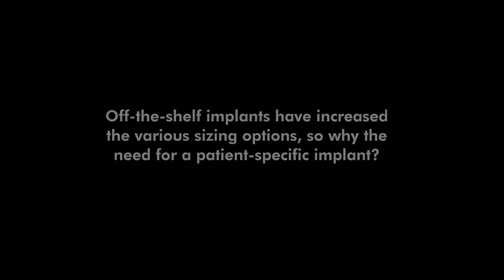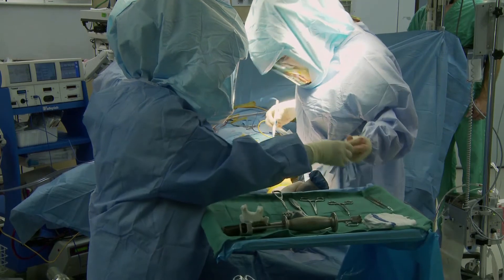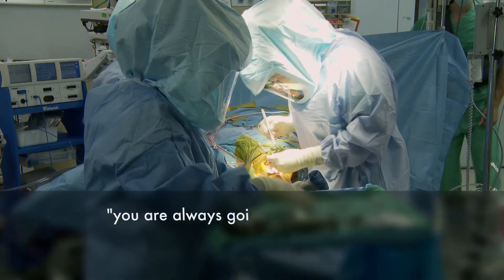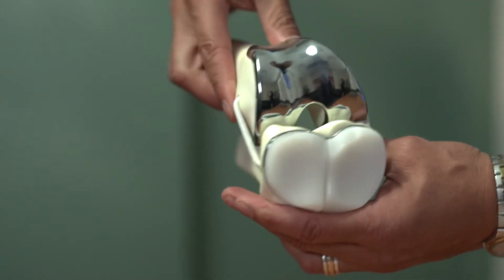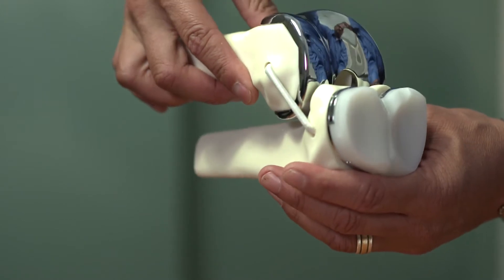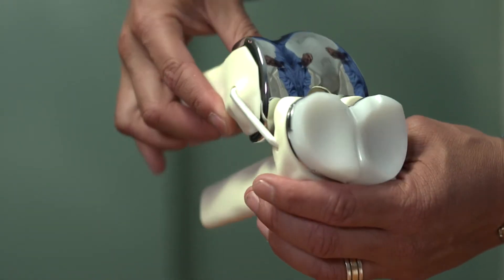Even as you try and increase the number of sizes, what you're trying to do is get closer and closer to that perfect size for the patient. Even as close as you can get, you're always going to have variance from side to side, front to back. If you have a patient-specific solution, then you're really mapping that entire anatomy — so it's not just two coordinates that you're trying to match; it's really the entire anatomy all the way around, and that's what we're seeing with the Conformist solution.